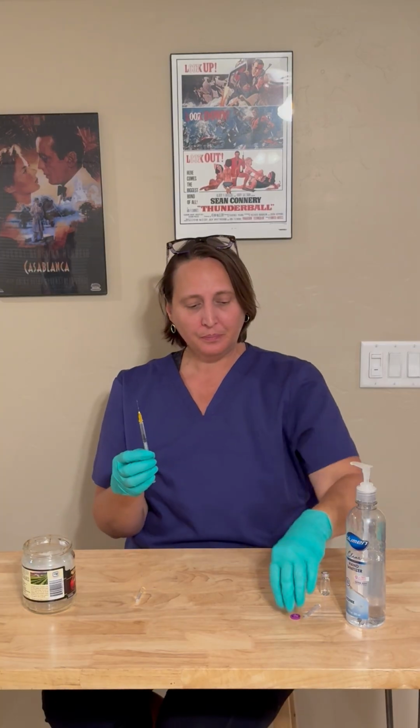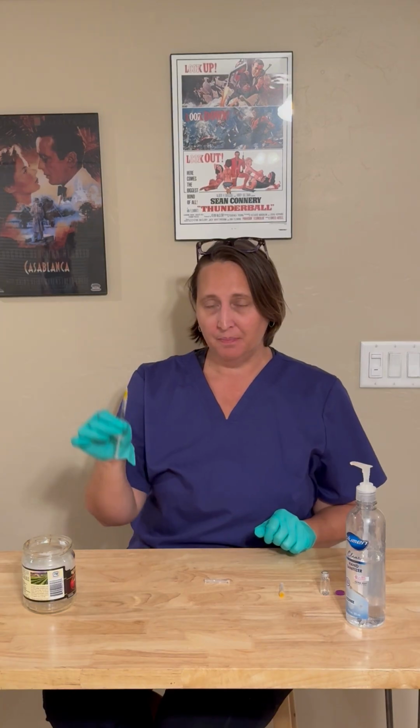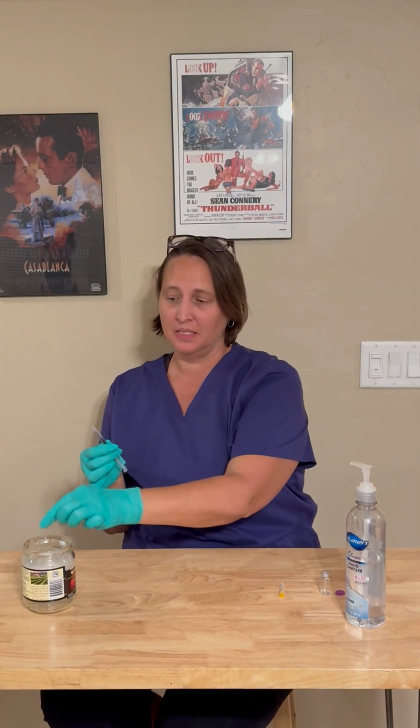Withdraw the vial gently from the top of the needle. And at this point, you'll want to recap your needle so that you can dispose of it and apply the second needle. So you're going to use a one-handed scoop technique. You'll take your syringe in one hand, scoop up the cap, and settle it on the needle. Then you'll take your other hand, once it's covering the needle, and just secure it down. At this point, you can remove that needle and put it in the sharps container.